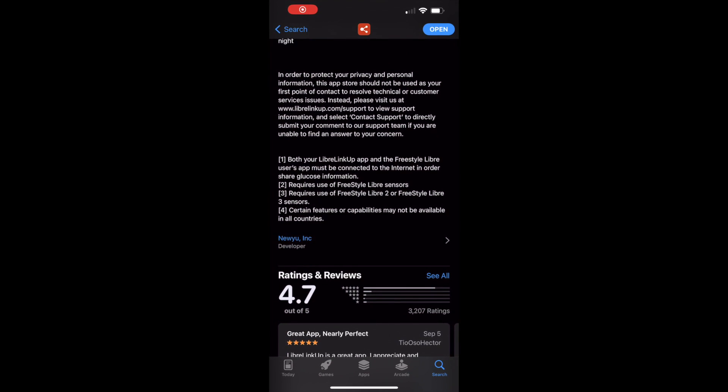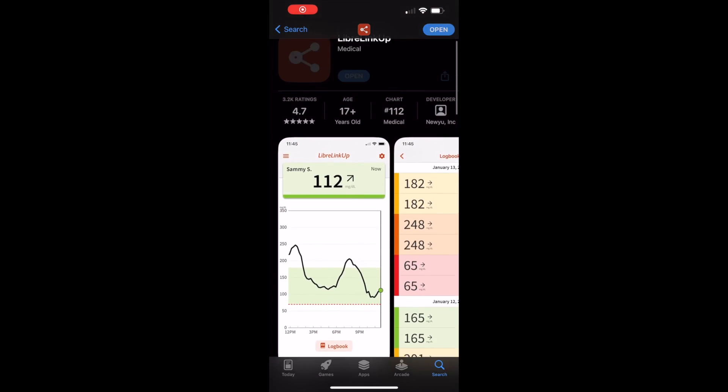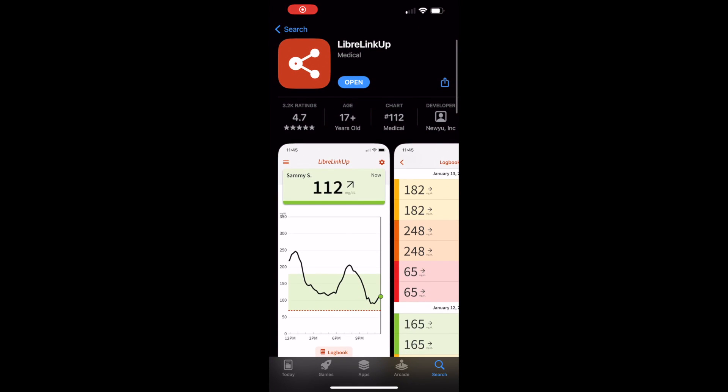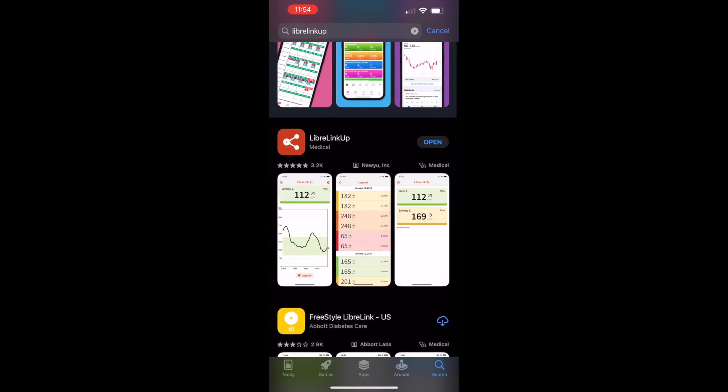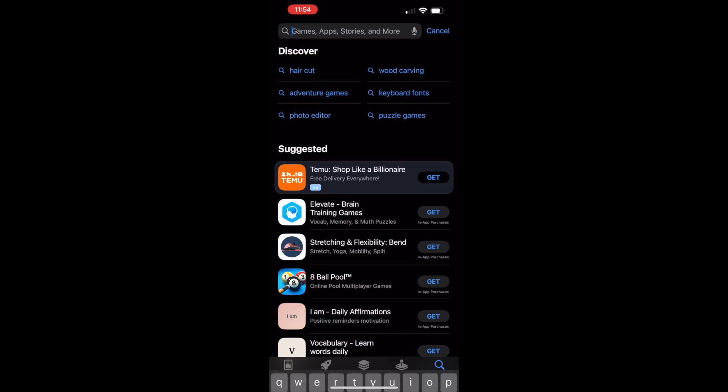Hi, I wanted to show you how you can use the Libre Linkup app, which is by Abbott, and another app called Diabeto.